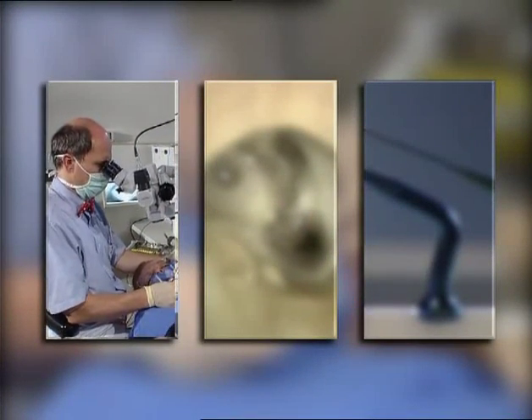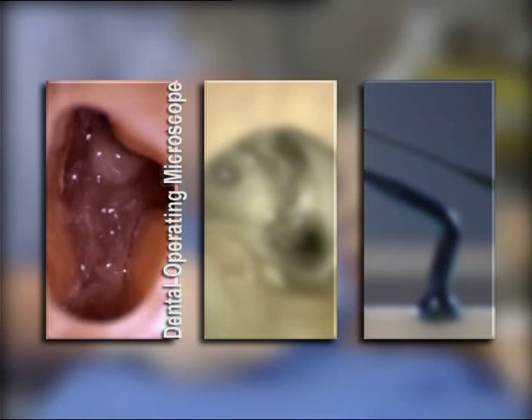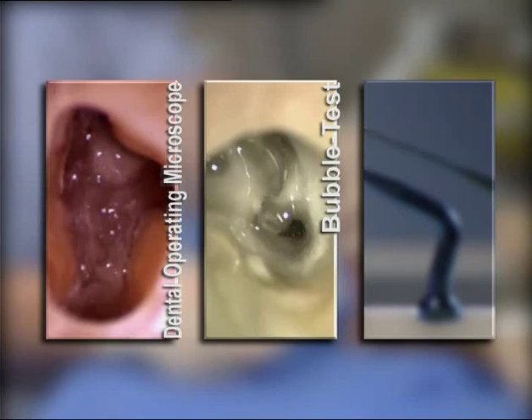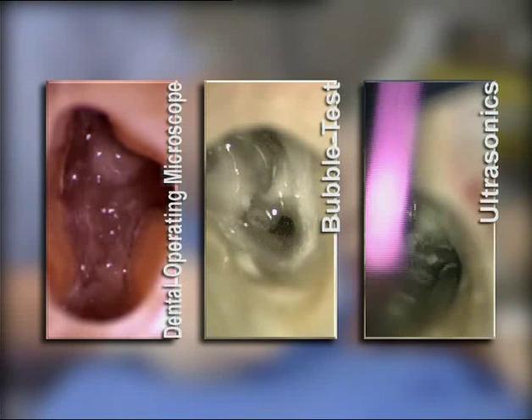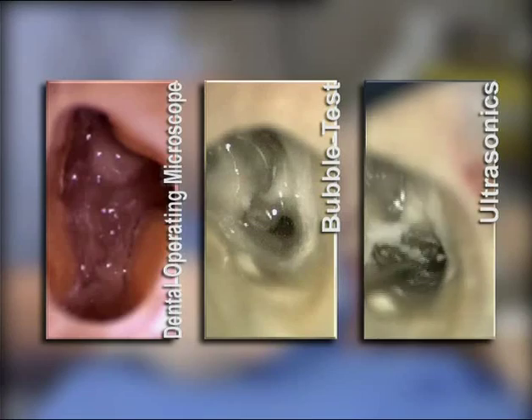The operating microscope can better visualize the anatomic footprints, such as the developmental grooves. They display different color and translucency than the surrounding dentin. The champagne test with sodium hypochlorite: sodium hypochlorite sets off oxygen in contact with pulpal tissue of non-instrumented canals. The use of specifically designed ultrasonic tips allows the removal of restricted tooth structure with optimal visual control and very high precision.